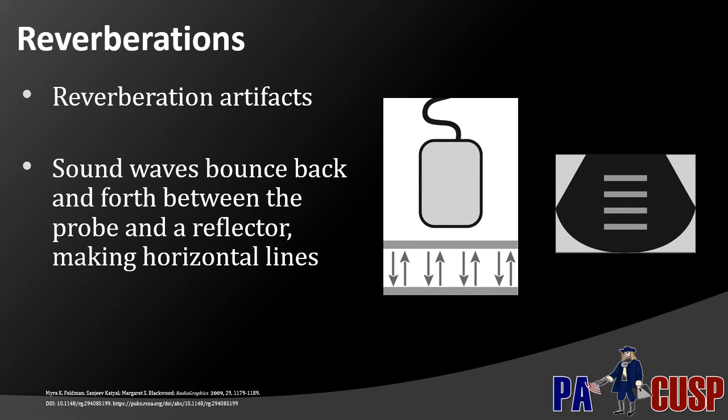either through the first set and back, the second reverberation and back, or the third reverberation and back, the ultrasound probe doesn't realize that this is the same beam that it initially sent off a while ago, and it's going to assume that these are new echo reflections coming back from deeper and deeper structures as the time course is longer in between the transmission time and the reflection time.